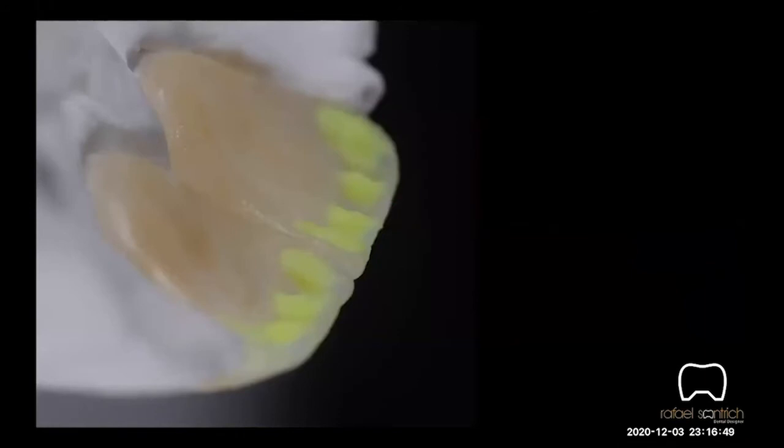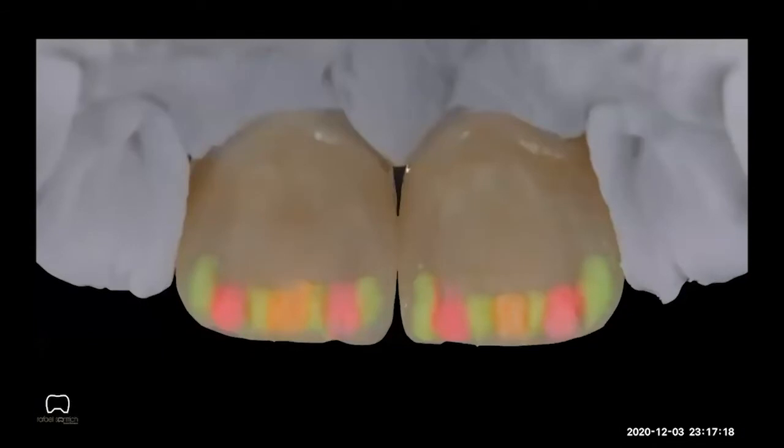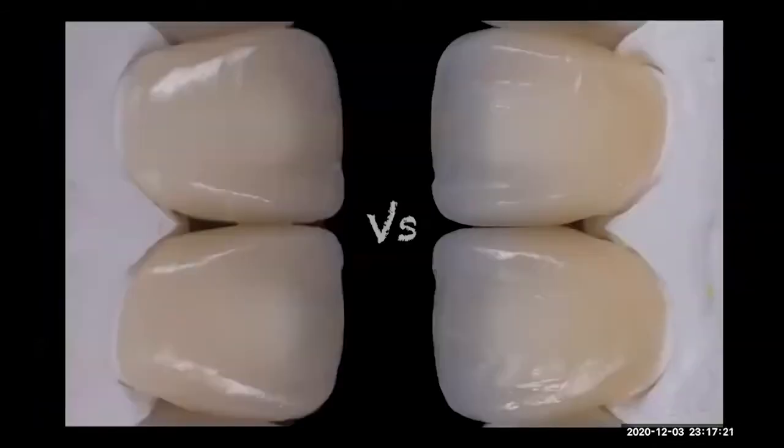So if I put blue stain in distal and mesial, I need to put blue enamel in distal and mesial. If I put a little bit of cream in the mamelon area, I need to put a little bit of mamelon light. Okay, we can create some translucency with clear, and then we cover everything with enamels. So we need to do the same build-up that we do from buccal, but from palatal, okay? This is step by step what we do. That's the result of the 2 restorations.